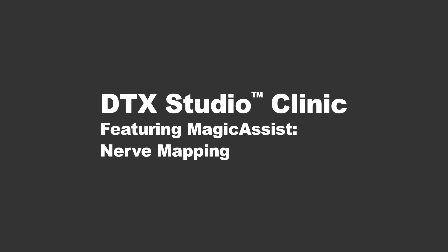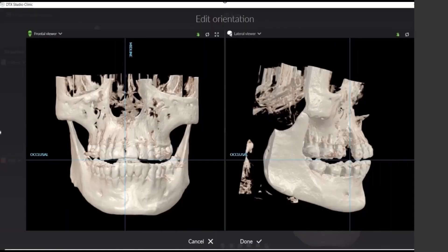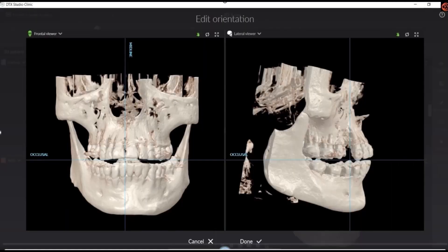In order to show how valuable this next AI feature in DTX Studio is, we'll start first with going through the typical tasks that are required in a 3D software.